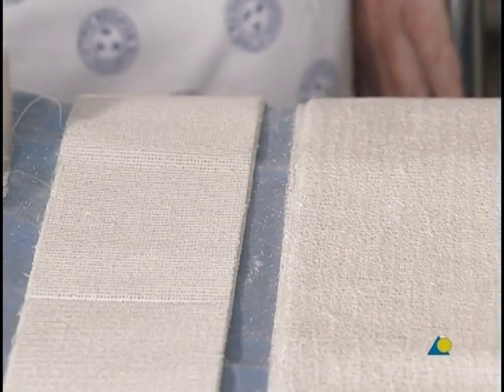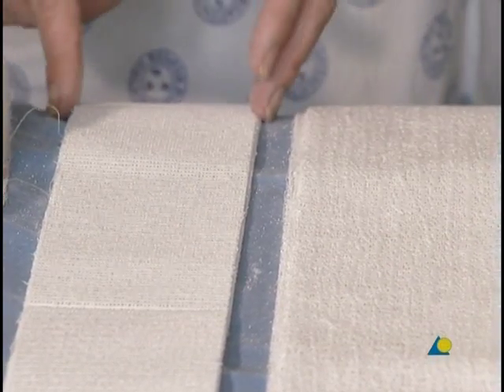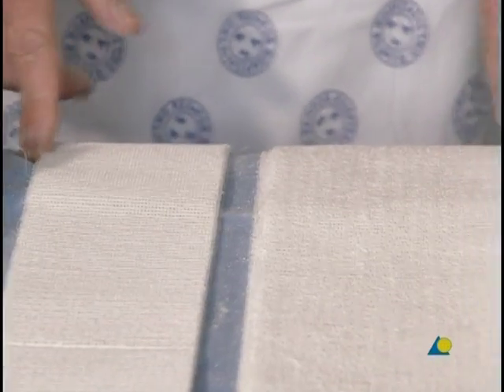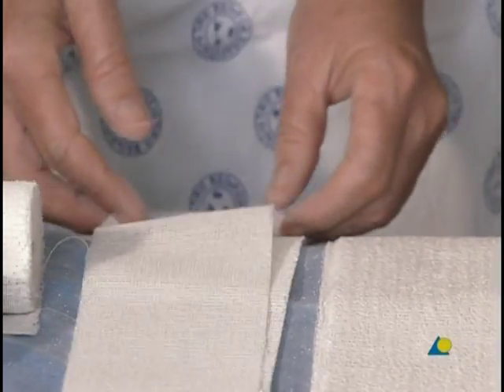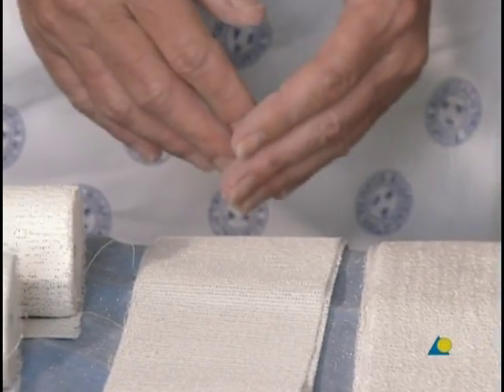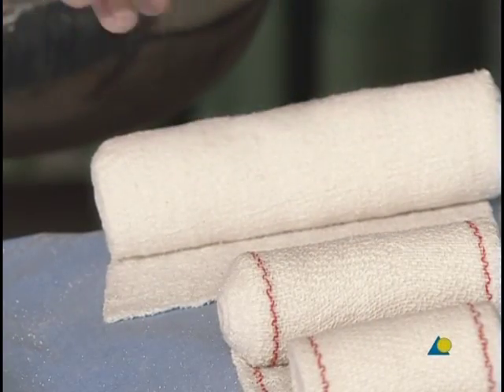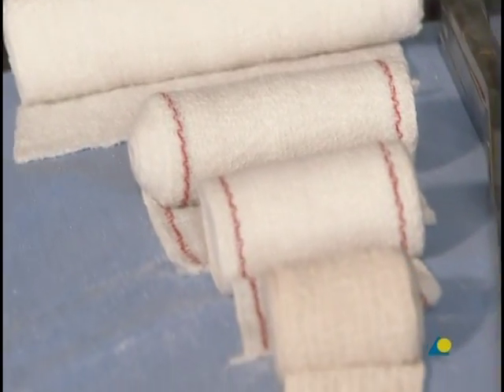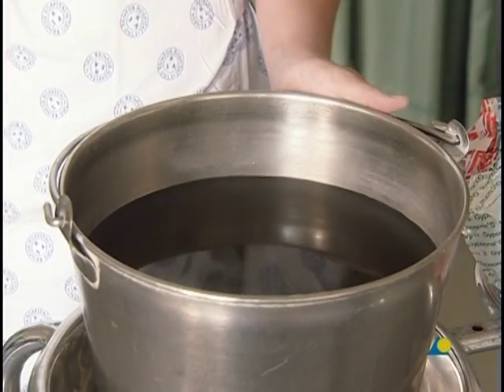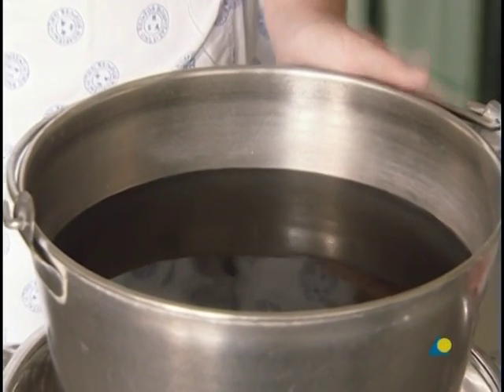A plaster slab, generally five layers thick, is available in differing widths. In this case, a 150-millimeter slab will be used. For a smaller patient, a smaller slab may be appropriate. A crepe bandage is used to secure the plaster slab, along with water or another wetting agent.